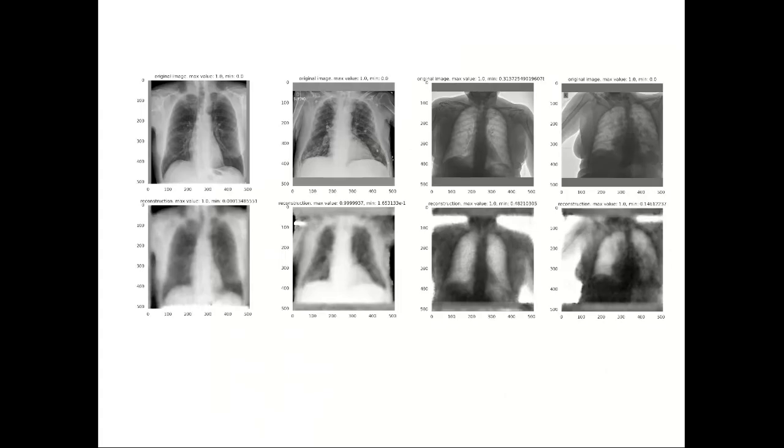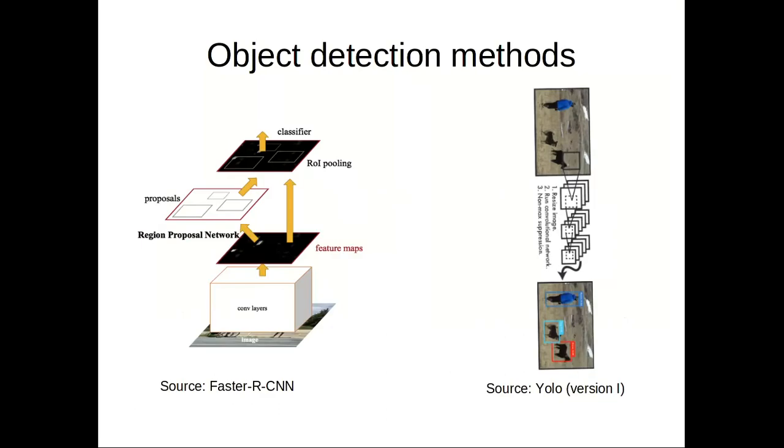And here you can see some examples of the bone removal abilities of the trained model on the target dataset itself. Each upper image is the original one, and the lower image is the prediction of the bone removal model we just trained. The results, although not perfect, are reasonable enough for our current purpose and allow us now to move on to our main goal, building and training a COVID-19 opacities detector on chest X-ray scans.